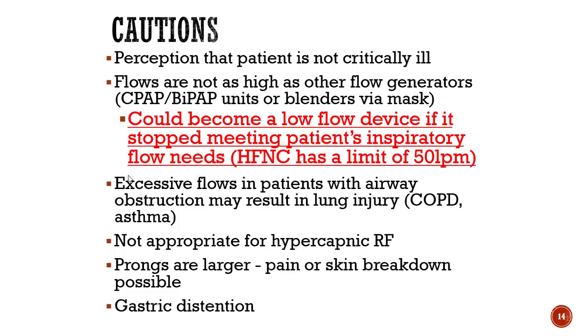Now, when you're getting to your little peanuts, like your premature babies, we do take that into consideration. We think about flows, we think about the creation of CPAP because they are so tiny that we are very careful about where we want flows to be, and we always are very conservative with those babies because they're so small that it does not take much for pressure to create a pneumo or create lung injury. For adults, that's not really a consideration that we take.